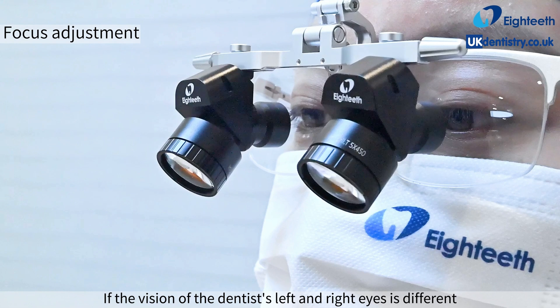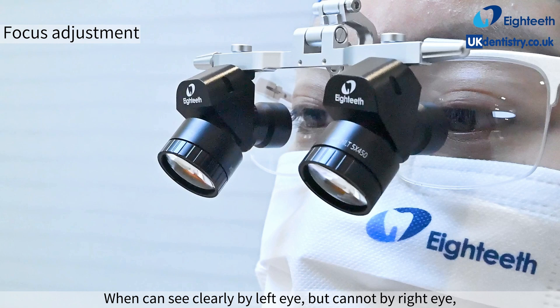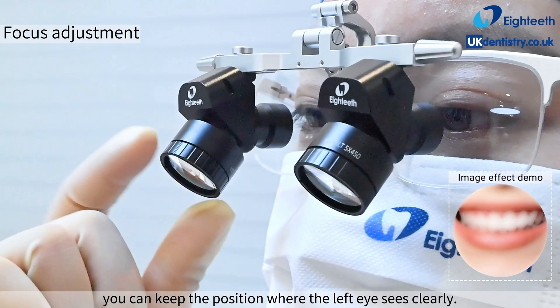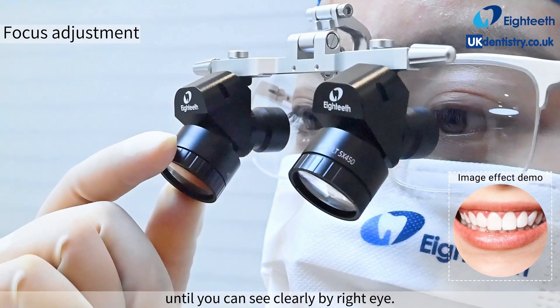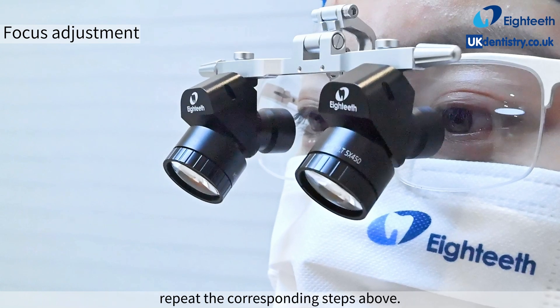If the dentist's left and right eyes have different vision and it has not been corrected with myopia correction: if one can see clearly with the left eye but not the right eye, keep the position where the left eye sees clearly, then hold the right objective lens and rotate it back and forth to adjust the focus until the right eye can also see clearly. If one can see clearly with the right eye but not the left eye, repeat the corresponding steps above.